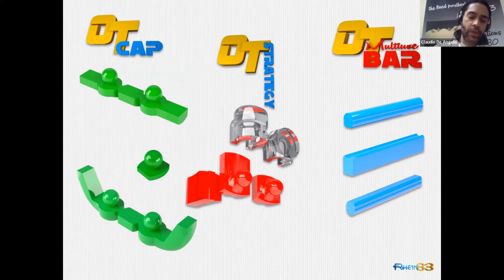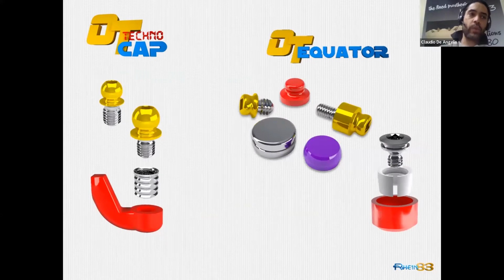The basic concept is that we work with something fixed in the mouth and then a retentive cap or clip embodied in the metal framework of the patient's denture. The idea is basically the same. Then we evolved this idea in many shapes and dimensions, but this is our basic idea.